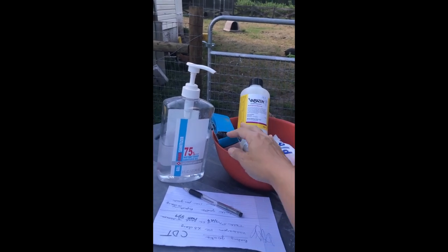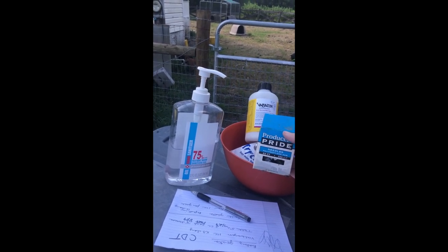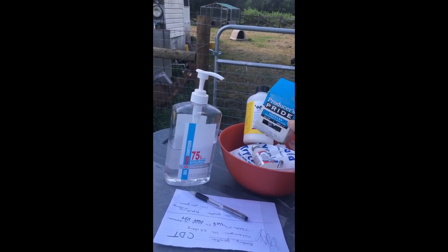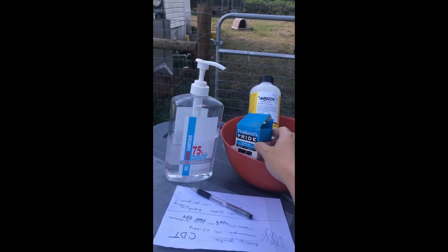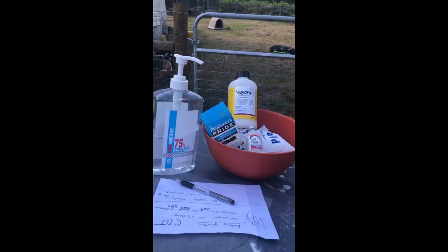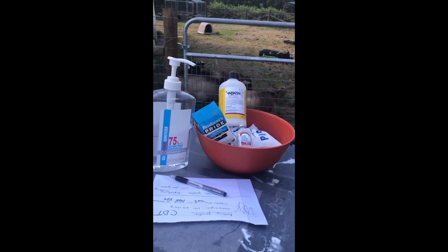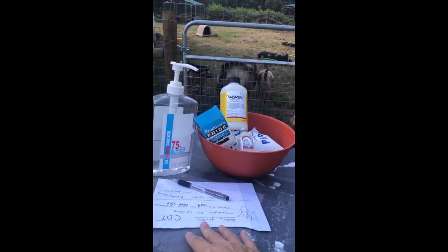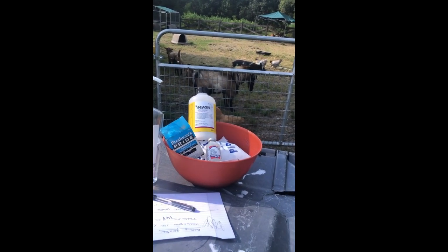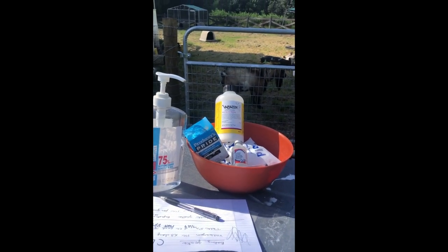I have the syringes and needles — 22 gauge. I don't like the 18 gauge because the bigger the number, the smaller the needle, and for the babies I don't like to hurt them so I use the smaller needle. I have some hand sanitizer to put a little alcohol on the injection site to kill some germs, a piece of paper and pen to take records. I do want to mention the Valbazen — that's a really good wormer we use for our babies too.